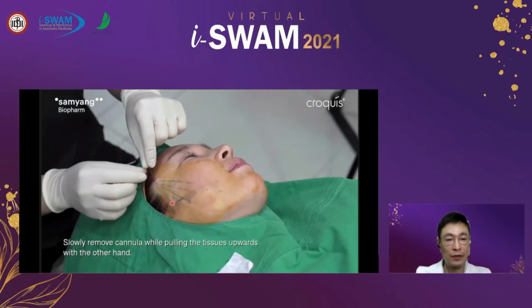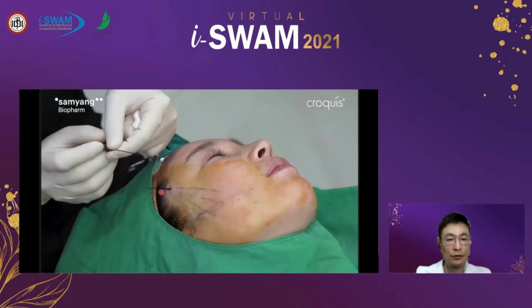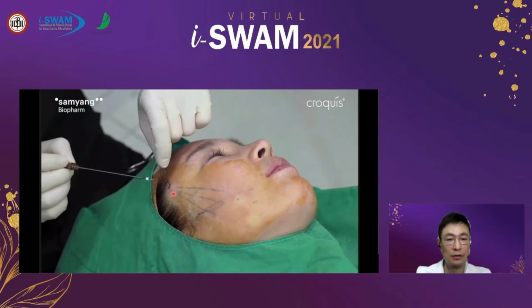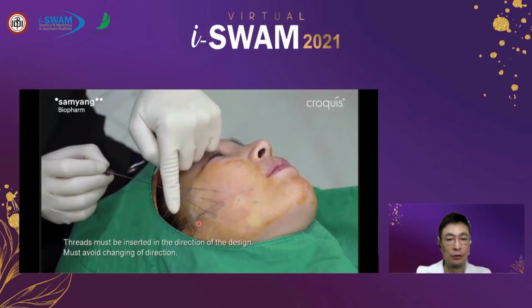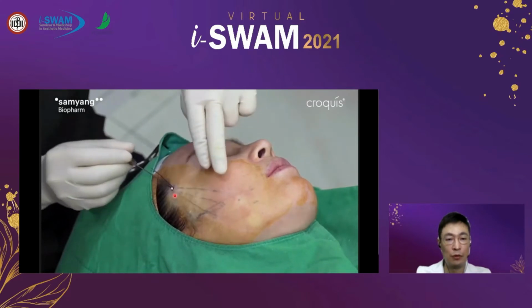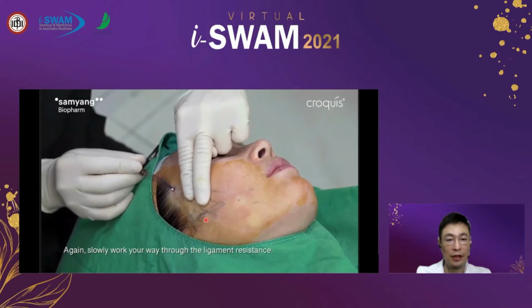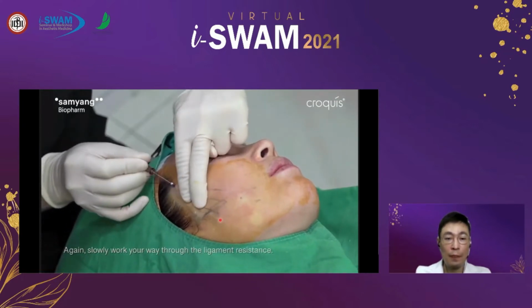After removing the cannula, I usually tie two knots using two threads. So before tying, put more threads as designed.